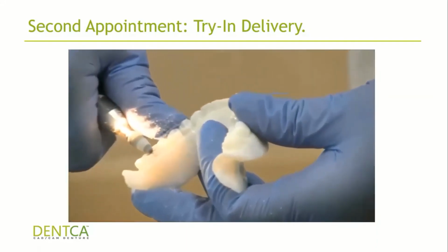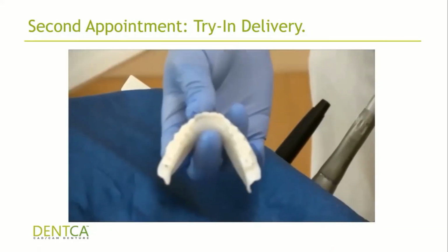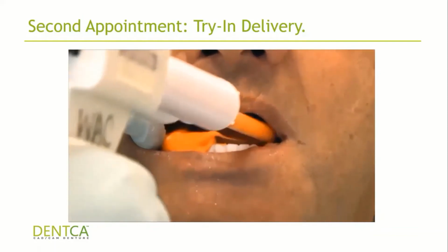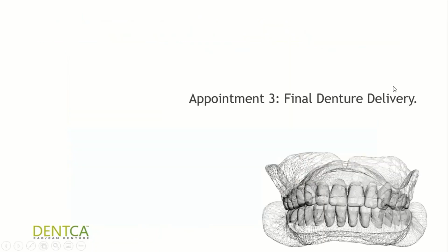If they're small areas and you only need to make small occlusal adjustments, I would just do them in the try-in just to make sure the patient's comfortable, but keep in mind you will need to do them again on the final if you do not take a new bite. So that is pretty much what happens in the appointment.